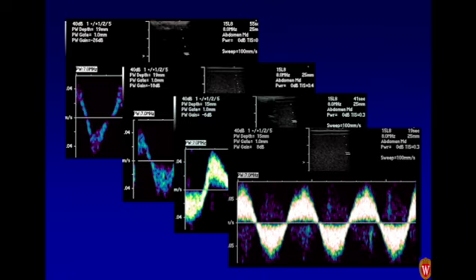If you bought an expensive stereo, one of the things the person selling it to you will talk about is channel separation. How good the stereo is at separating channel A from channel B, from the right from the left. With good expensive systems, they're very good at it. They keep this from happening. But in cheaper systems, you'll get this crosstalk. And so at higher volumes, the stereo doesn't sound so good.